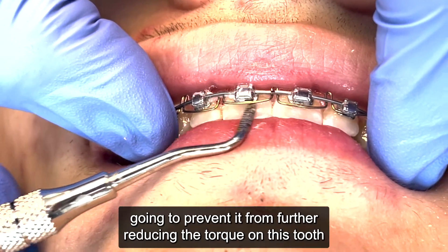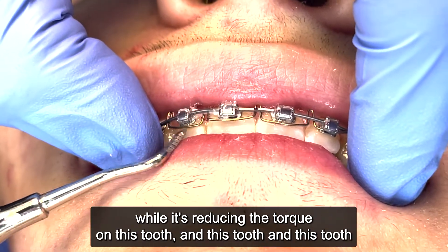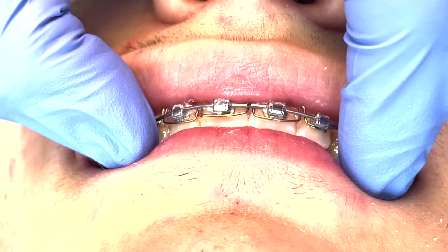This is going to prevent it from further reducing the torque on this tooth, while it reduces the torque on this tooth, this tooth, and this tooth. That's our quick recap for today.